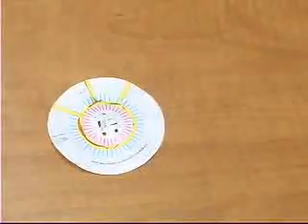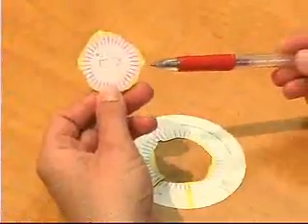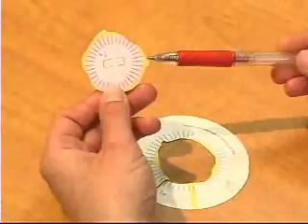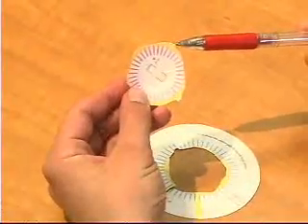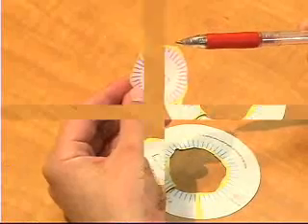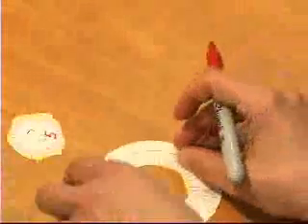Scoring of the circle task is done by counting all of the areas of blue around the inner circle and all the areas of pink in the outer ring. Each color mark is assigned 5 points, up to a total of 100 points. The cutoff time for this task is 300 seconds.